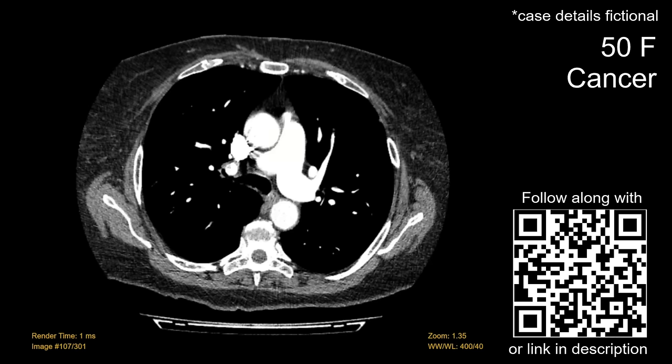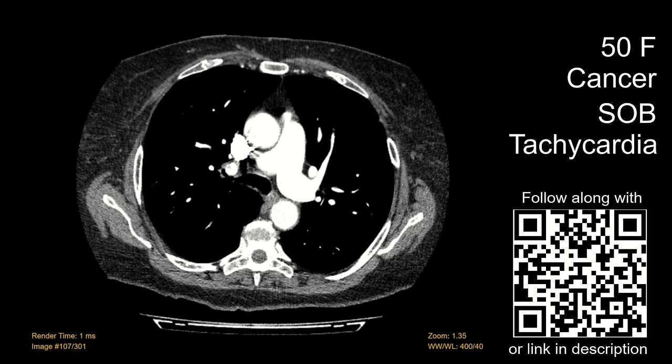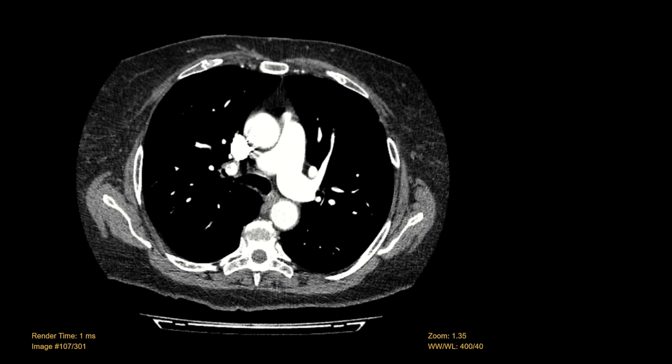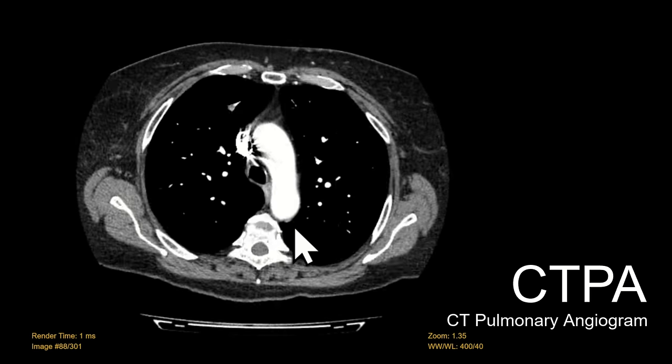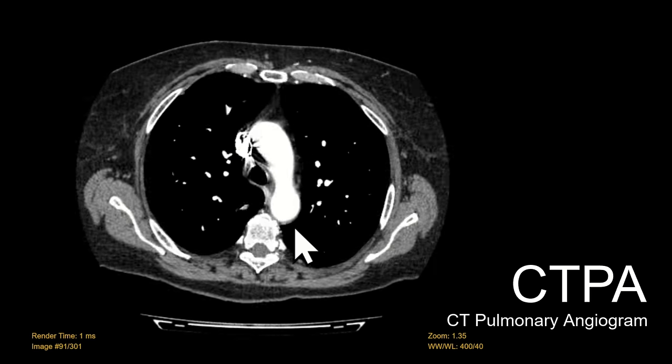A 50-year-old woman with a history of cancer has worsening shortness of breath and goes into the emergency department. Her heart rate is 120 and her other vitals are normal. A CT is ordered to rule out pulmonary embolism, and this is the CTPA that was performed.